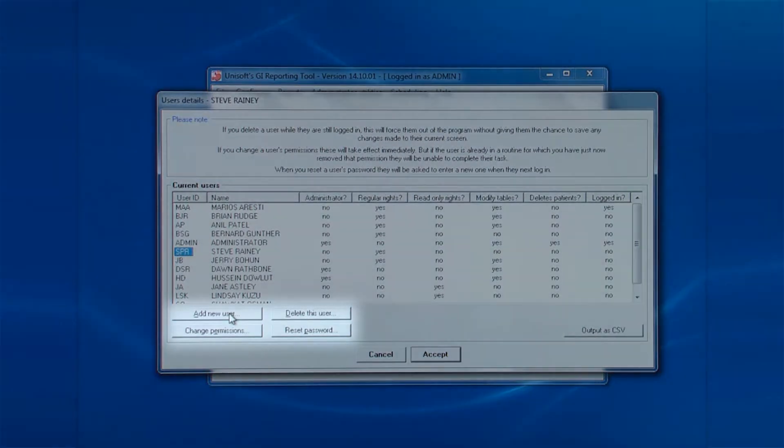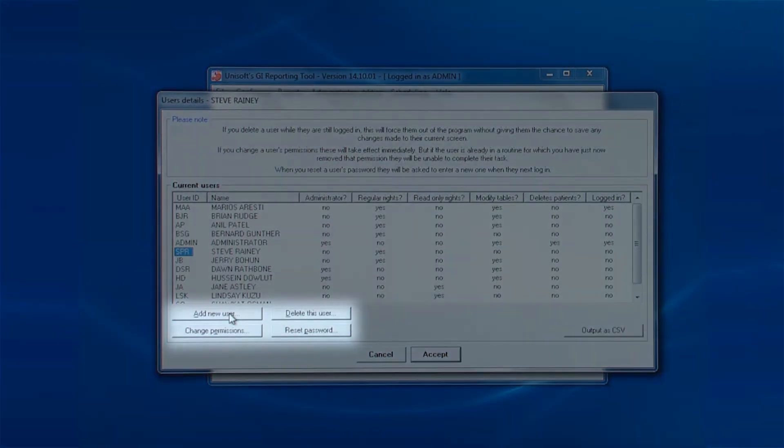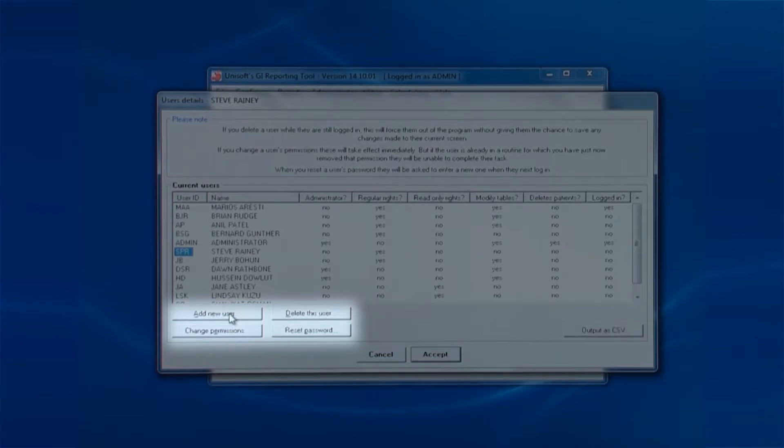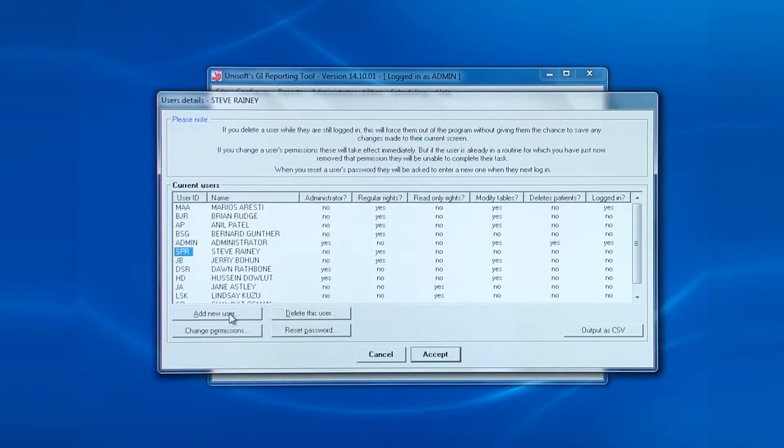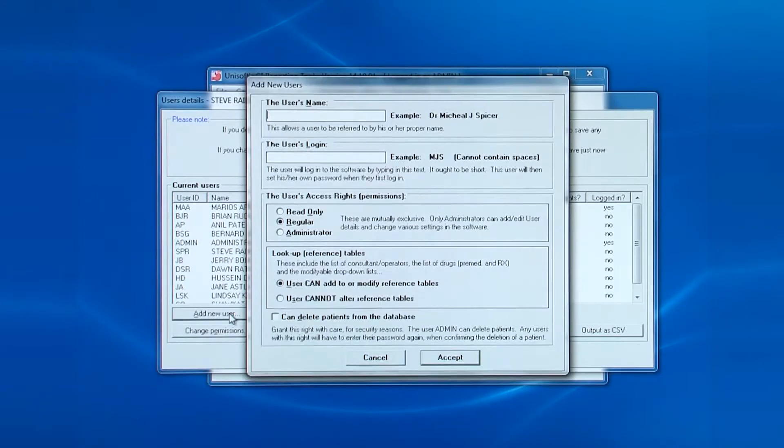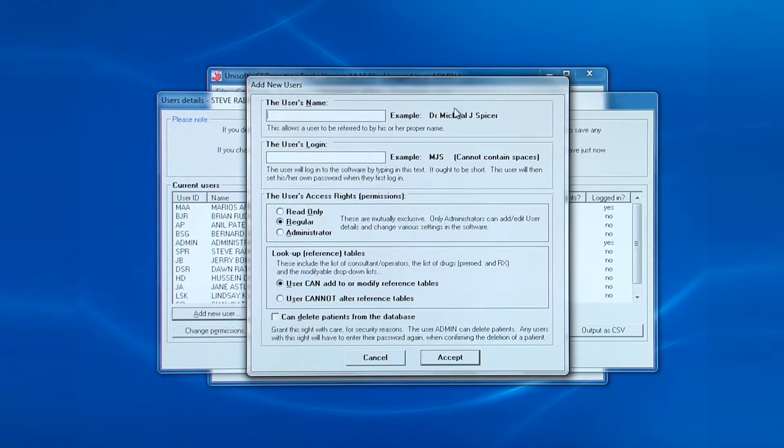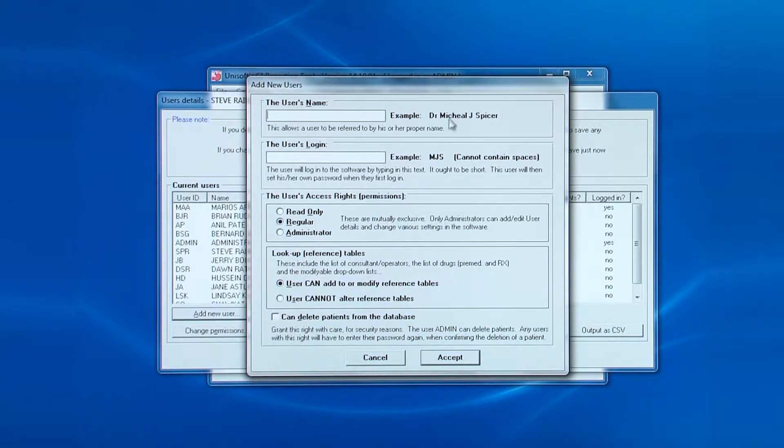The first button of four is add new user. When you click on a login, the remaining three buttons become enabled. Firstly, we'll look at adding a new user.